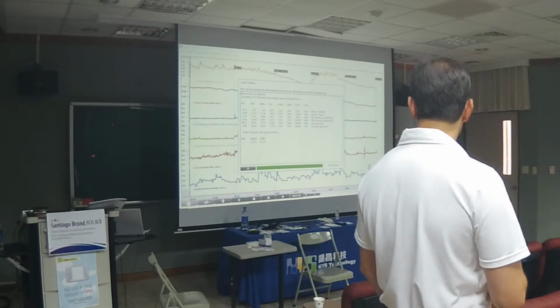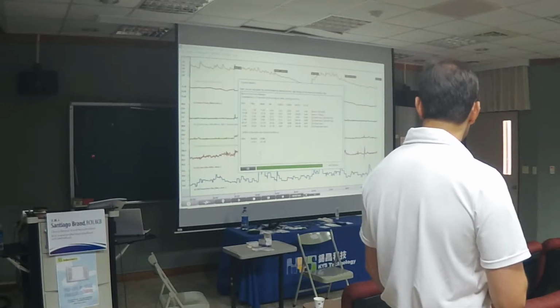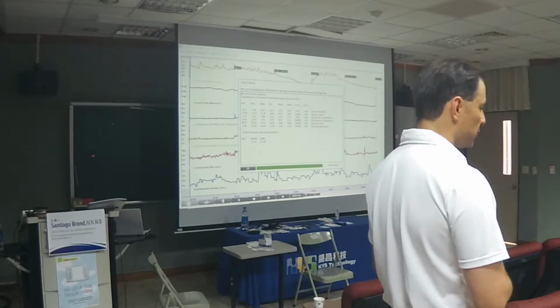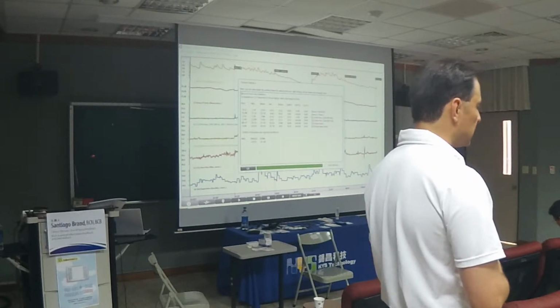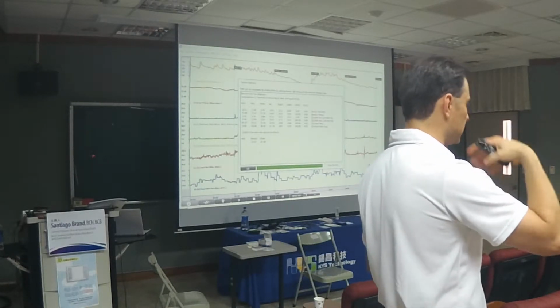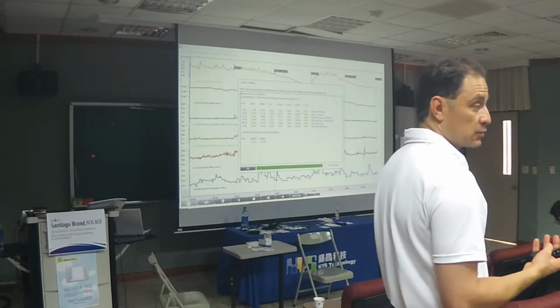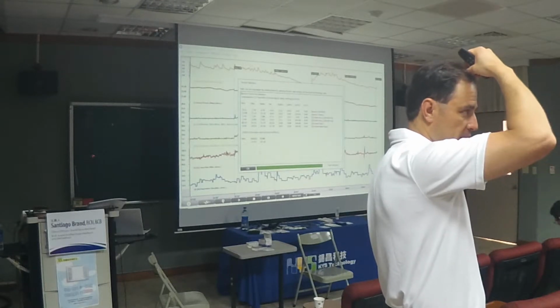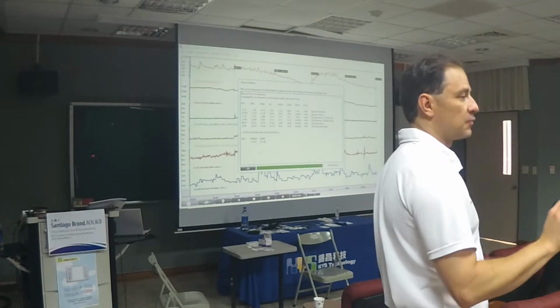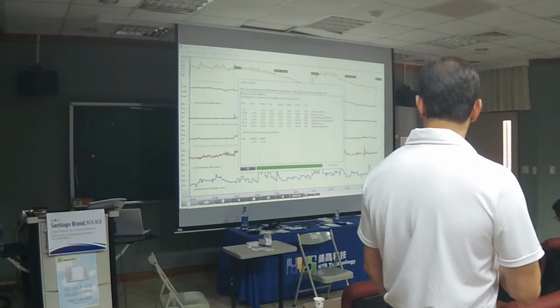And the GSR is 6.545. That's high. Now, GSR also correlates with mental rumination, cognitive rumination. Is that something that happens to you? Thinking about, if you make a mistake during the game, do you think about it over and over sometimes? Yeah. So it correlates with rumination, an active anterior cingulate cortex. All right. So this can help bring rumination down, fretting and anxiety, give more cognitive flexibility too. So we have those values.